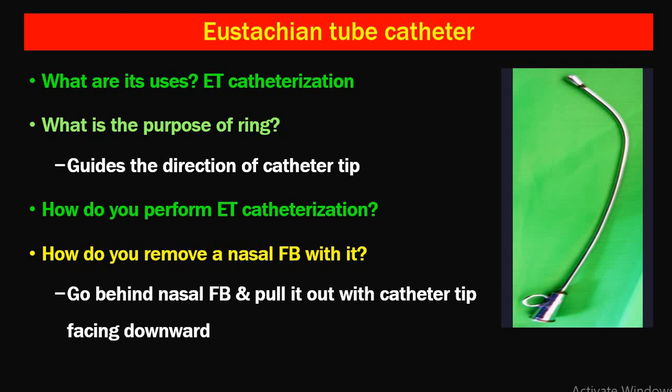The next instrument is the Eustachian tube catheter, used for Eustachian tube catheterization as a test for Eustachian tube patency. The ring guides the direction of the catheter tube — as you move it up, down, or laterally, the ring indicates the direction. It can also be used as an adjunct for politzerization.